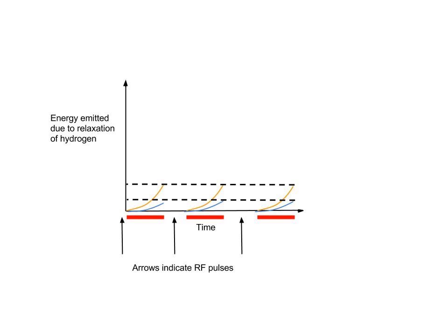And that's because this second RF pulse once again puts the orientations of the hydrogen nuclei into this excited state where they're different from the orientation of the static magnetic field. But then, once this stops, relaxation begins again. And you can see I've repeated this for a third time here.